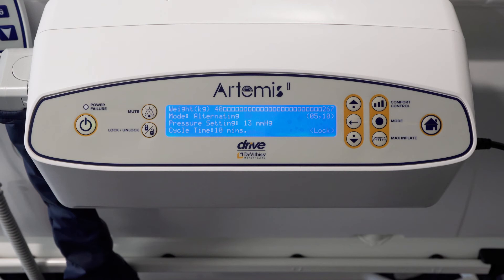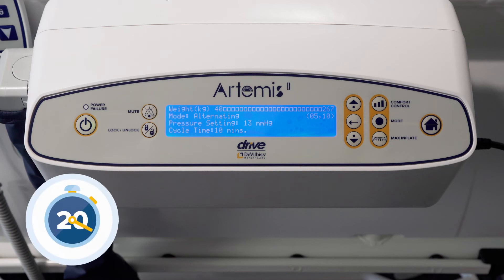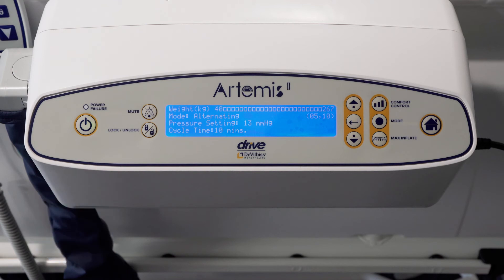The control unit locks out all functionality after two minutes of inactivity, indicated by the lock icon in the right corner of the home screen. Press the lock button to unlock the pump. The mute function silences the audible alarm and will re-alarm after 20 minutes if the cause is unresolved. The audible alarm sounds when the power is switched off — press alarm mute to silence.